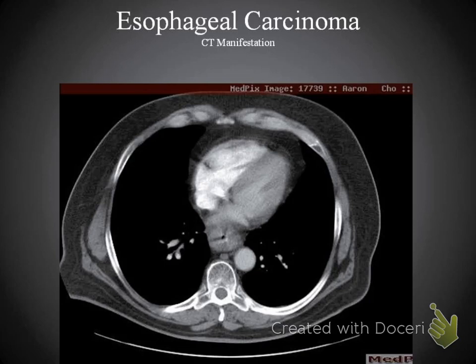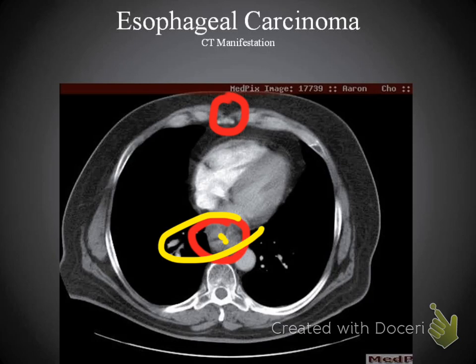Here's another example. Notice that we have the sternum here and here is the esophagus, so retrosternal pain could possibly be present in this patient. We see that the wall is very thick and the lumen is very narrow, so this patient does have esophageal carcinoma as well — maybe a slight degree of enhancement here. Pain and difficulty swallowing are some of the classic symptoms for this patient.